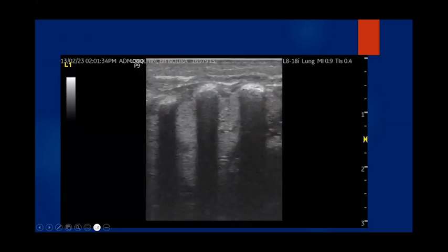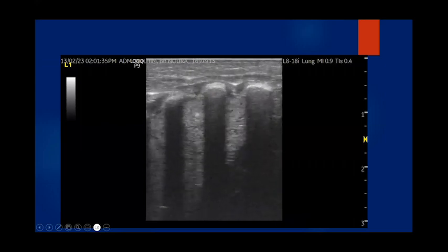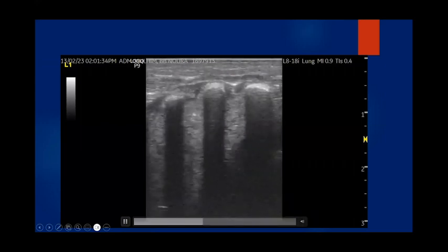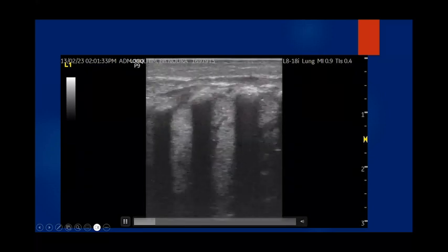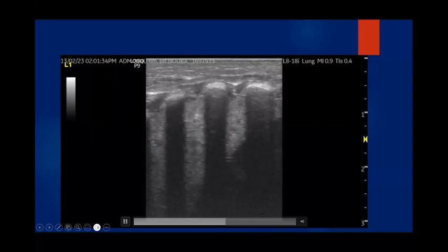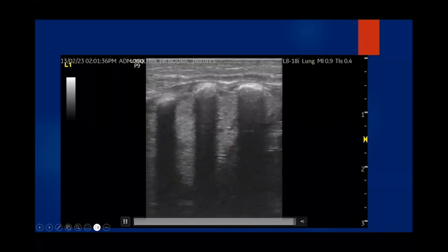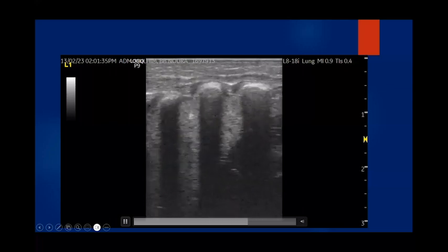Let's go to this slide. This is also a quite interesting one. What we can see here is that the lungs are moving, and we see things inside it that look like airways, and that's what they are. They're actually airways. This is called an air bronchogram. Just like what we see in X-rays, we can see it in lung ultrasound as well.